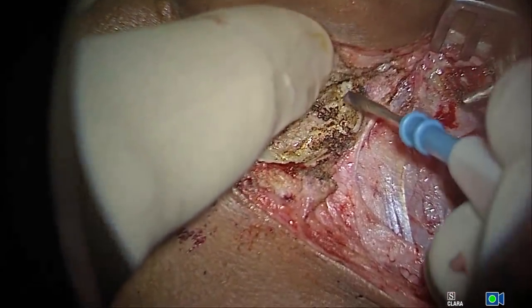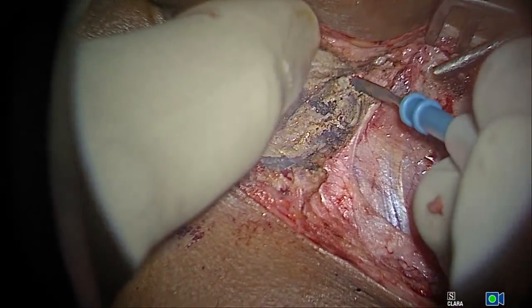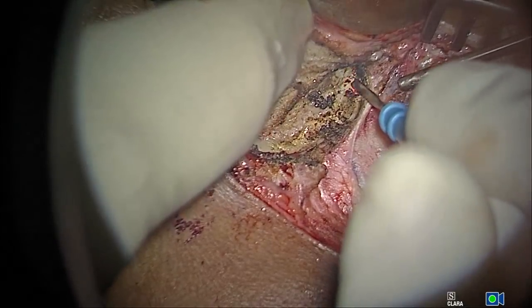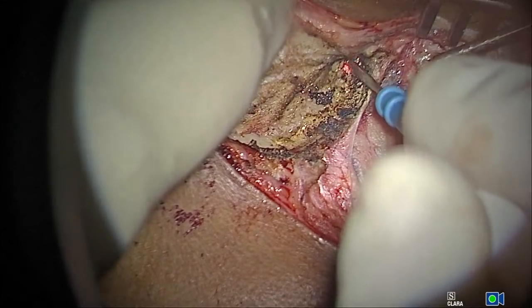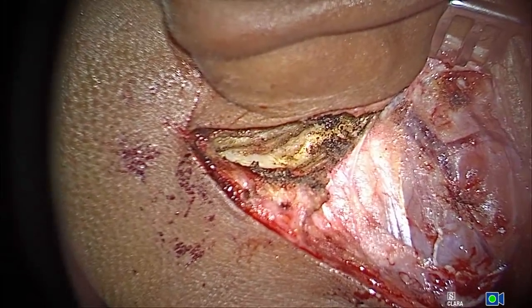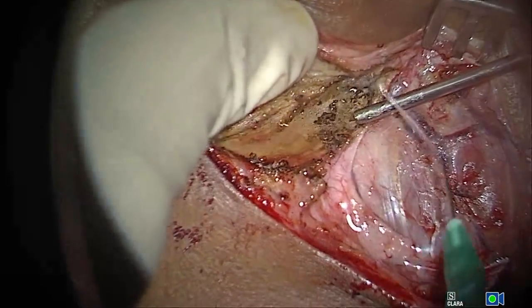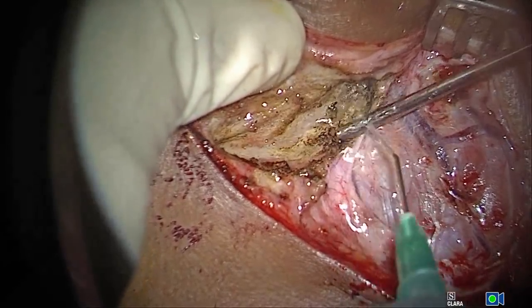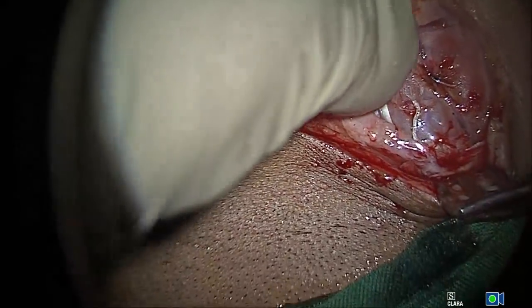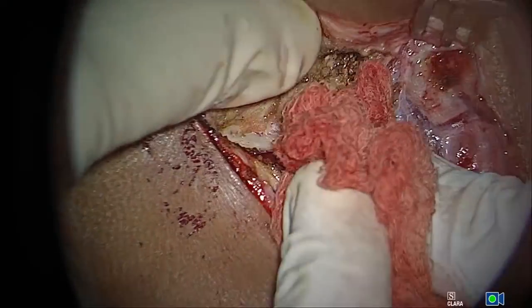Irrigate a little. Don't want that black stuff there. Just irrigate. So I'm just going anterior, anterior, and anterior. So that's it, I have done it. Irrigation, please. Suction. Okay. Now having done that, I'm going to elevate. You can see the Henle spine.